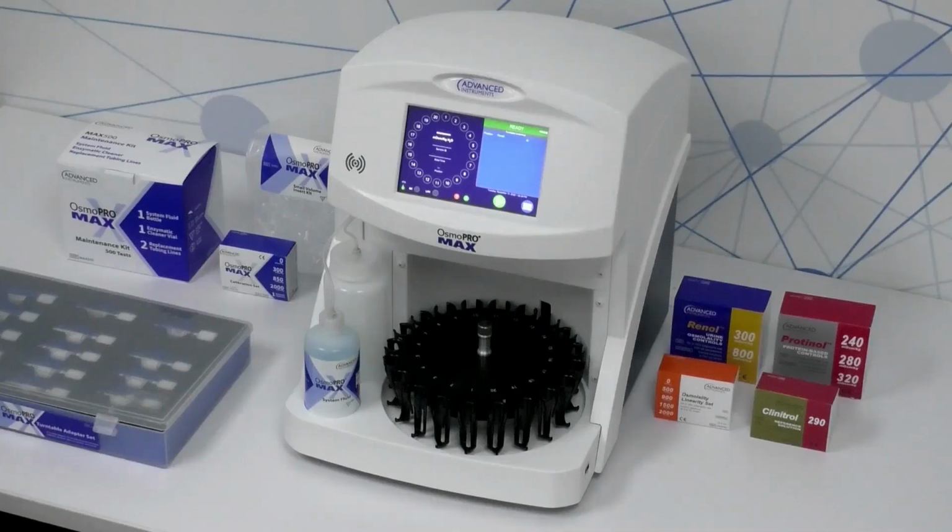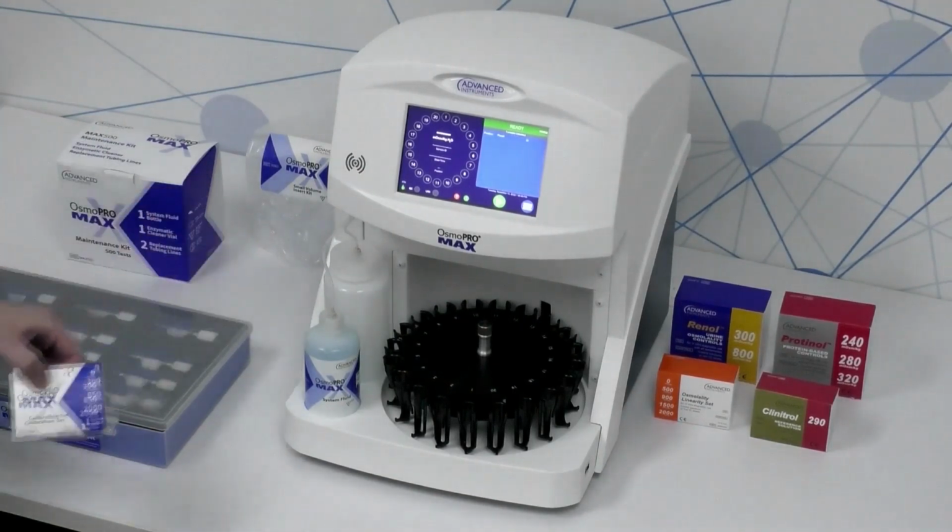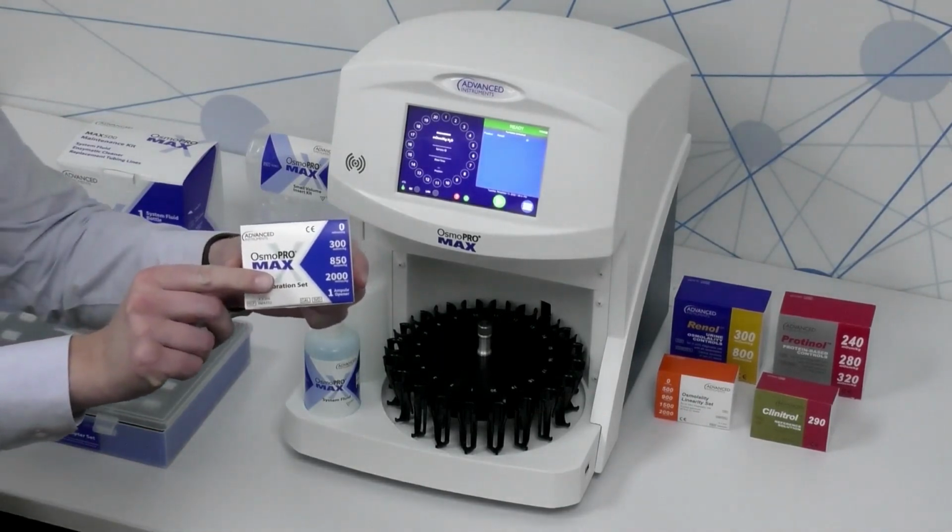Moving on to calibration, this process will be infrequent with the OsmoPRO MAX. The instrument arrives factory calibrated, with recalibration only expected to be performed approximately once every 6 months. All levels required for calibration are included in the calibration kit.